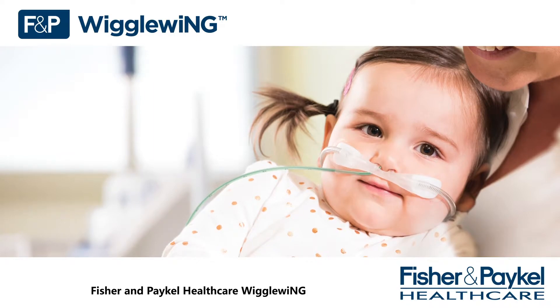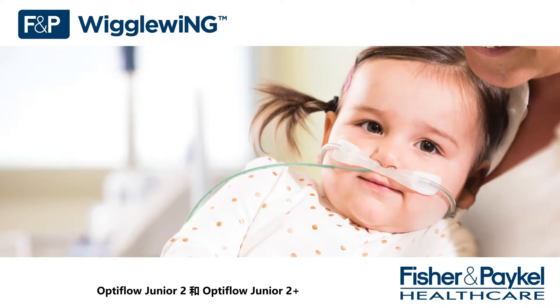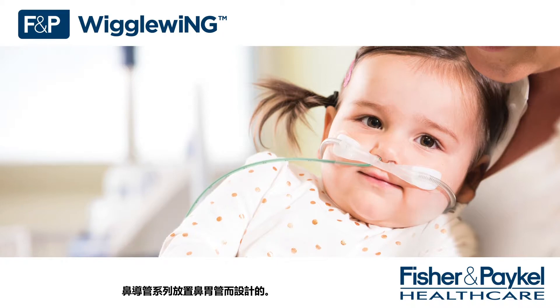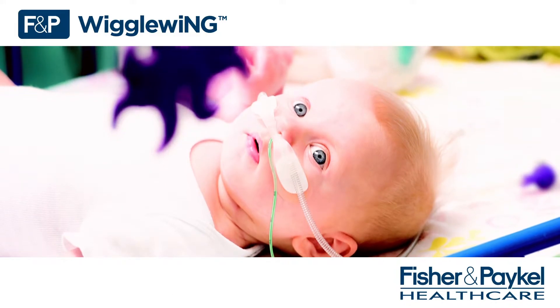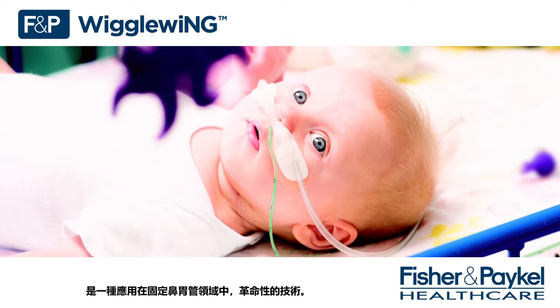Fisher and Paykel Healthcare Wiggle Wing has been specifically designed for the application of nasogastric tubes with Optiflow Junior 2 and Optiflow Junior 2 Plus cannula range. Working in parallel with our award-winning Optiflow Junior cannula range, the FMP Wiggle Wing is a revolution in NG fixation.